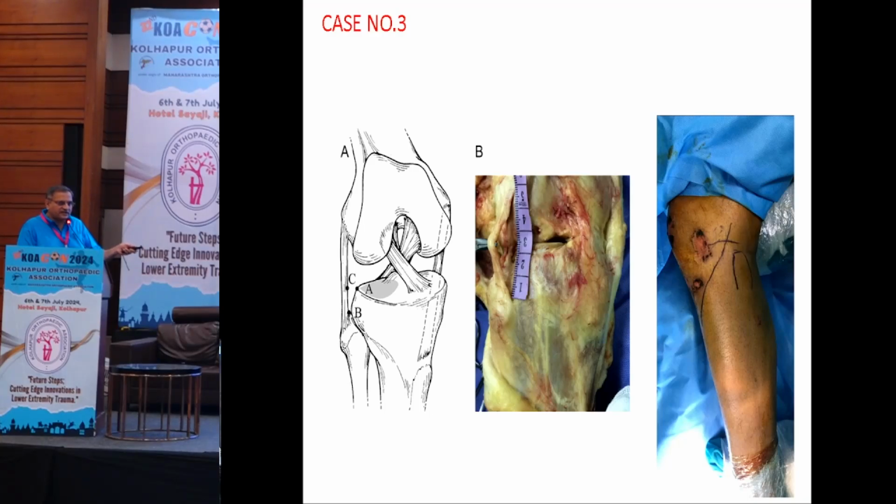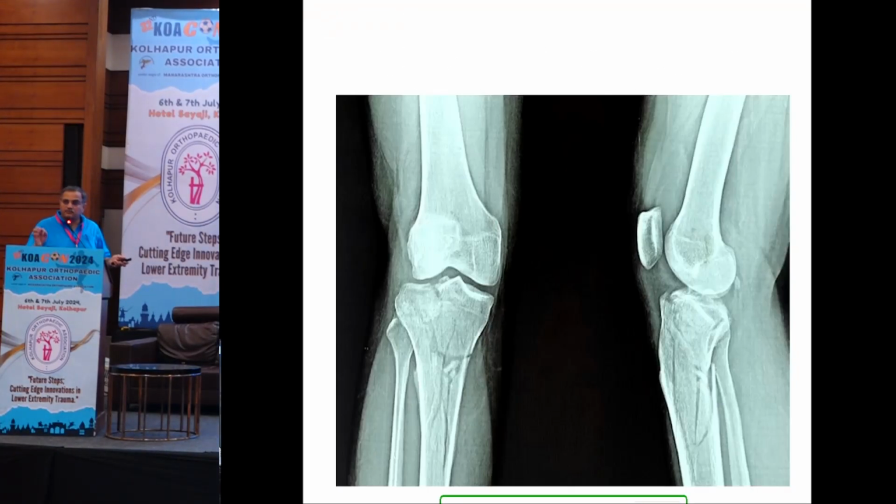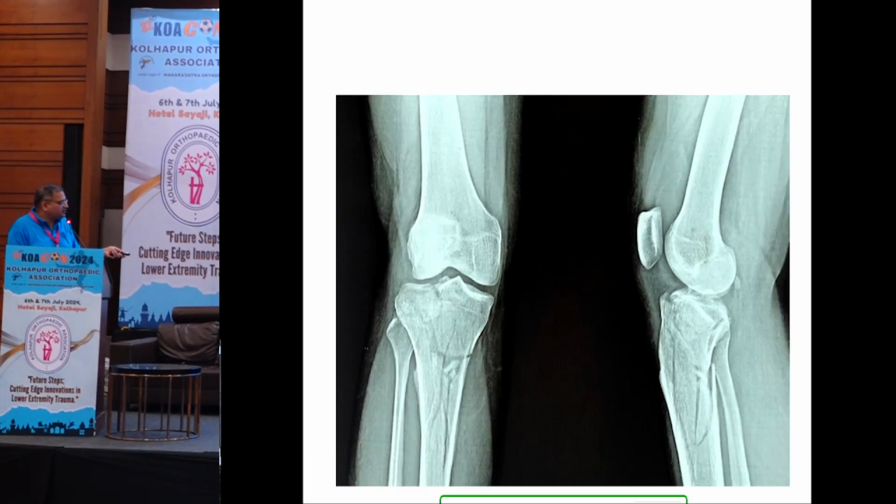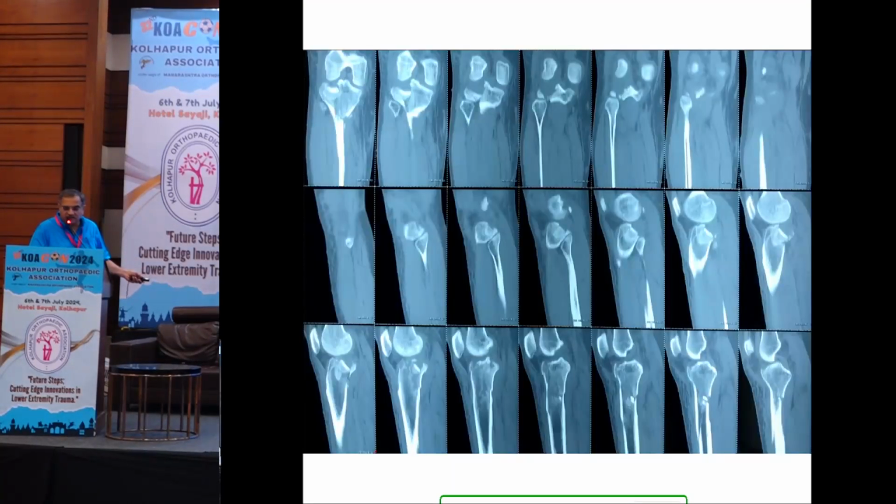Only thing is proximally it extends posteriorly above the fibular head, and there, if you keep a bolster in the distal thigh region, that helps to give varus, and you can peep in the joint very easily. And then you have to beware that you will not cut the fibular collateral ligament. If you give a varus force, you can actually palpate it, and then you can isolate it. In this part, I am not going to talk about the medial fixation which was required in this particular case.